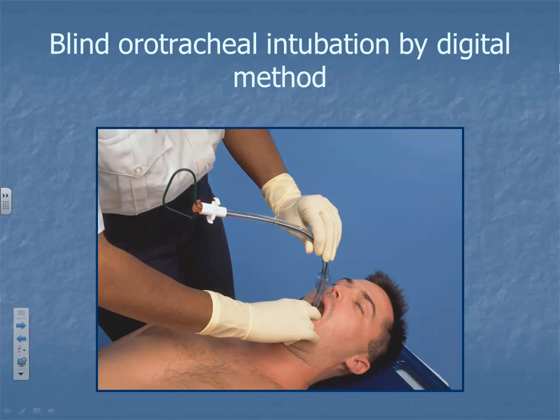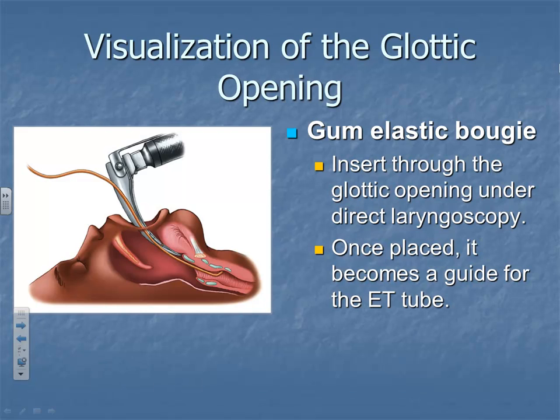Anyway, so this is a digital intubation. There's nothing wrong with doing this. My very first field intubation was a digital intubation because of the way the patient was laying. We couldn't get to him. So that was kind of fun. But they must be profoundly unconscious. There's nothing wrong with doing it. You need to try it at least once when you're out there because it is kind of fun. It's very fast. You're not worrying about looking, do you see the vocal cords or any of that. You just walk your fingers down, you feel the epiglottis, and you just slide that tube in.